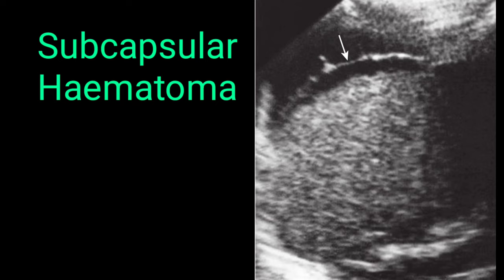On the report, mention that the spleen appears heterogeneous. Since the patient will have a trauma history and has been brought to accident and emergency, there is no doubt this would be hematoma. Mention that the spleen appears heterogeneous, there is subcapsular hematoma, give the size, and if possible provide the volume on your report.